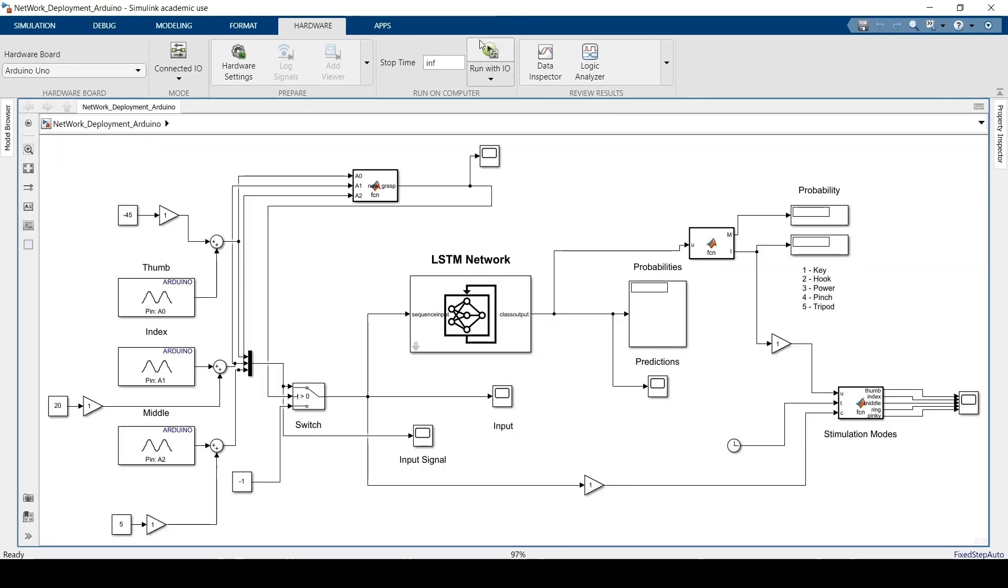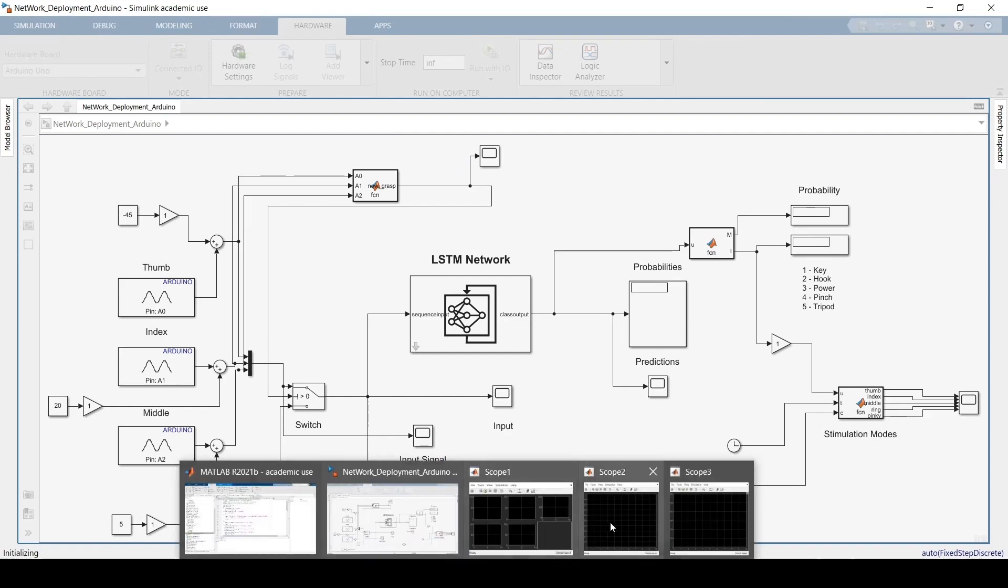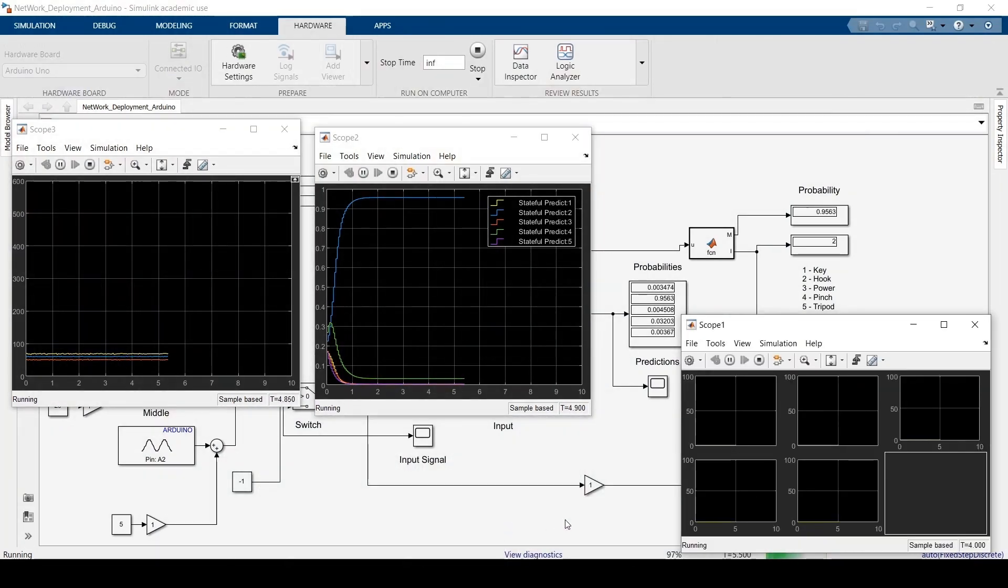Another form of simulation that we did with Simulink is to use the same setup I showed before but without the Adams model. In this case we can directly view the outputs and we perform multiple grasps. One important thing to note is we are constantly logging.